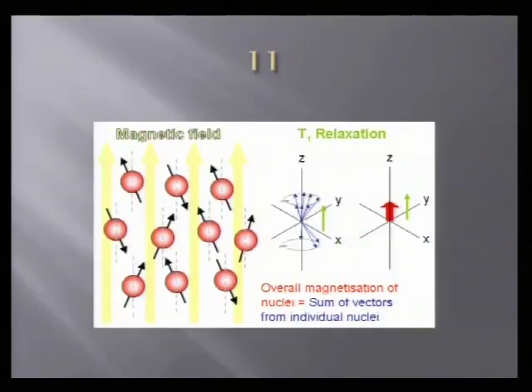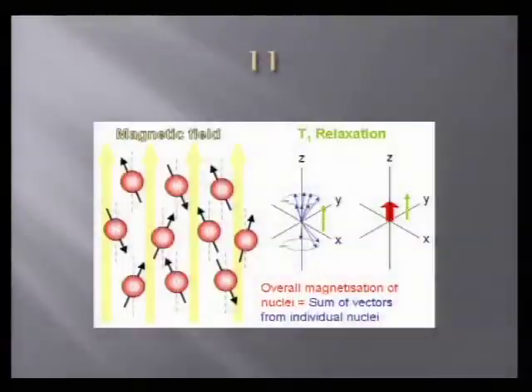I'm not going to go into too much detail. T1, T2, I'm sure you've heard these terms. What does that really mean? Whenever you impart energy on one of these protons, it goes into the XY plane and two different things happen. One is T1 relaxation, where it gives energy back to the main magnetic field, or the lattice. That's called spin-lattice relaxation. The other is that the protons dephase, which is called T2 relaxation, though it should really be T2 dephasing. The combination of both destroys the signal. Initially, right after you give the RF pulse, you have a ton of signal, and it goes away either by dephasing or by losing energy to the lattice, which is T1 and T2 relaxation.